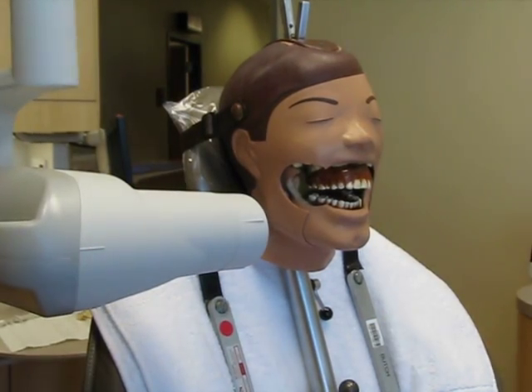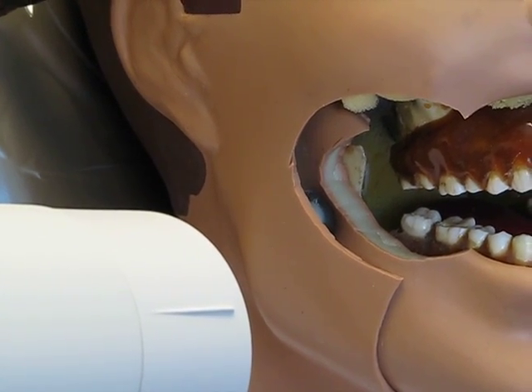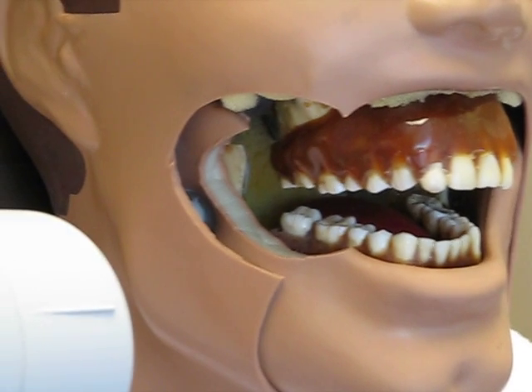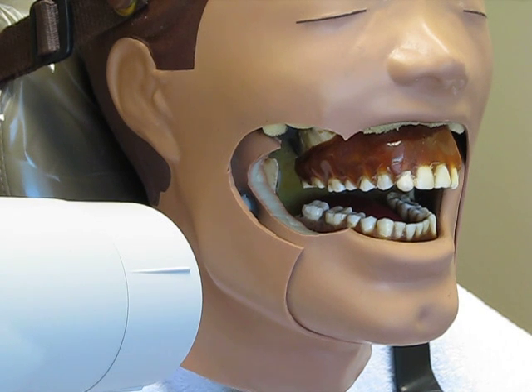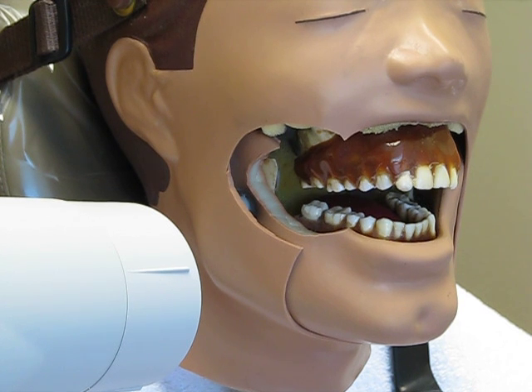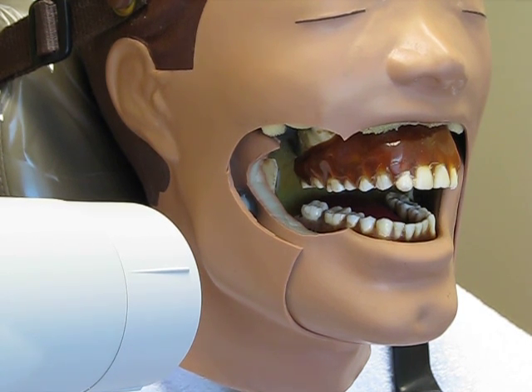So I'm going to zoom in on the mannequin now so we can see about placement. We want to remember that it has to be parallel, okay? Equal distance from the film to the teeth, and then from the cone to the ring. And then the indicator has to be parallel, the rod and the line on the cone, okay? Now every mouth is different, so not everyone will have teeth where they're supposed to be, or they may not have all of them, so we'll just have to work with it, okay?